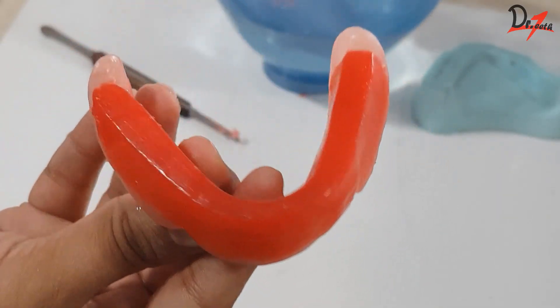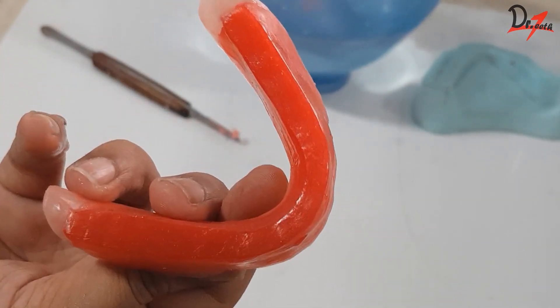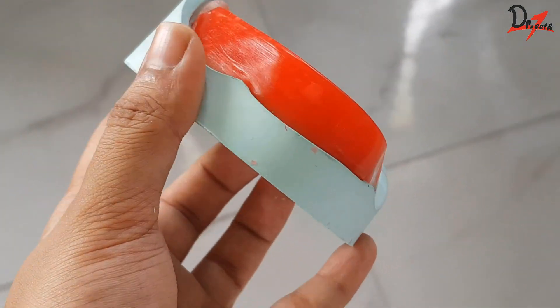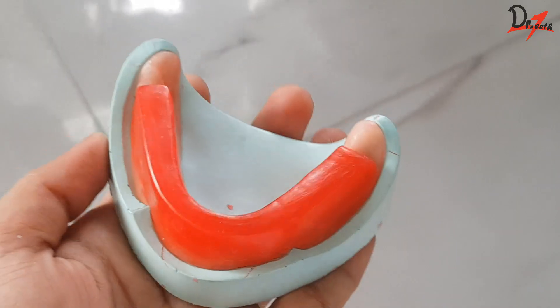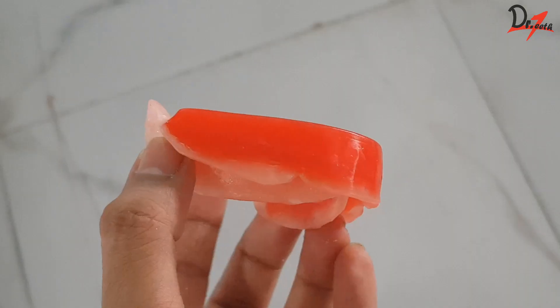Another method is that we can use a hand wash — take a dry cotton, use a little bit of hand wash, and rub it onto the surface of the rim and we will get very good shine. There are also some commercially available products that can give you a smooth surface and a beautiful shine, but I am not using it in this video.